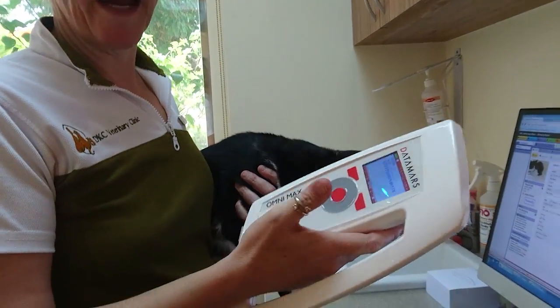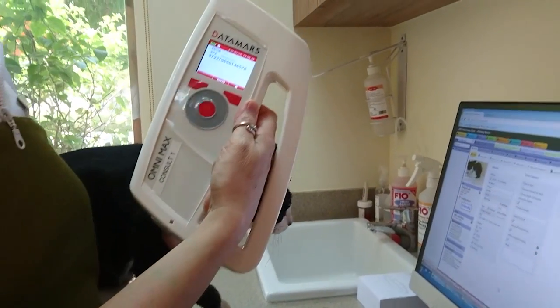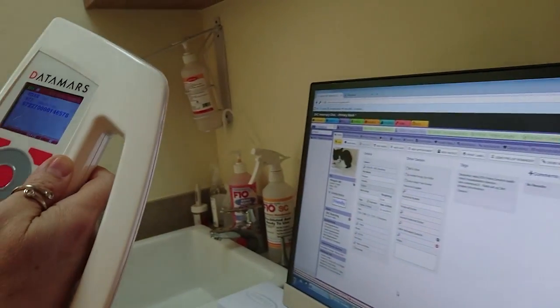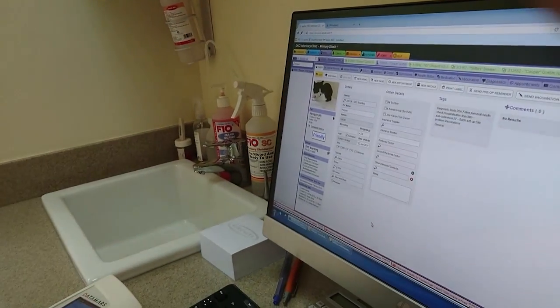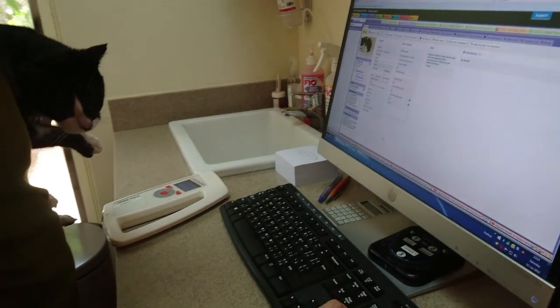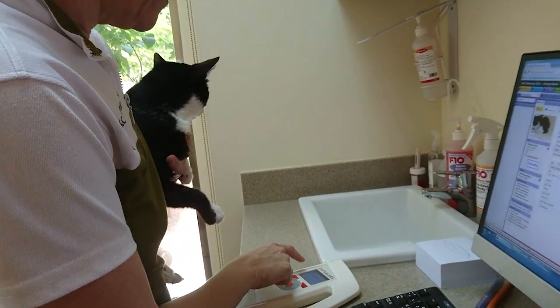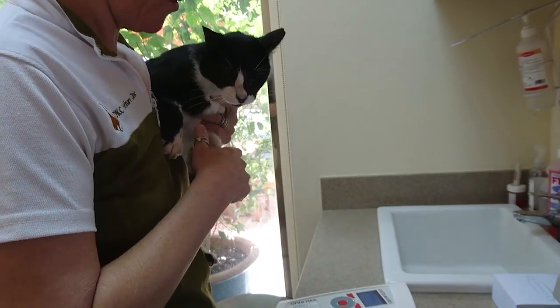So this is a microchip scanner, one of many that you can get, and if we scan him, his number comes up. And as you can see, it's a long complicated number, and usually what one does is sit and laboriously have to type the number out on the computer. It's all this long list of digits, and obviously people can make mistakes, especially when you've got loads and loads of zeros.